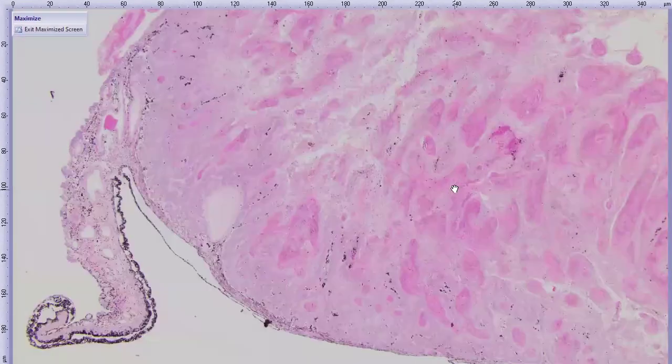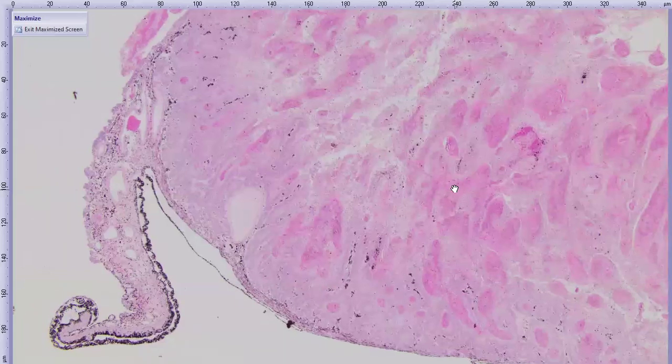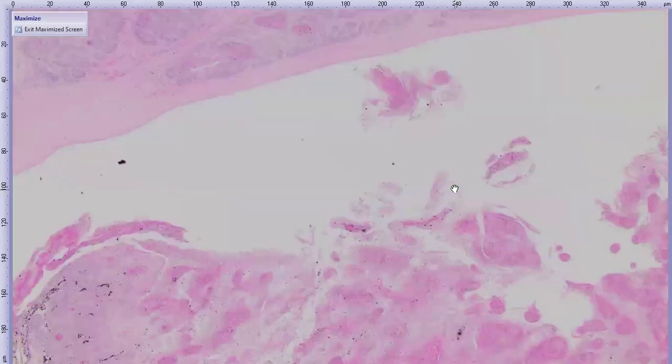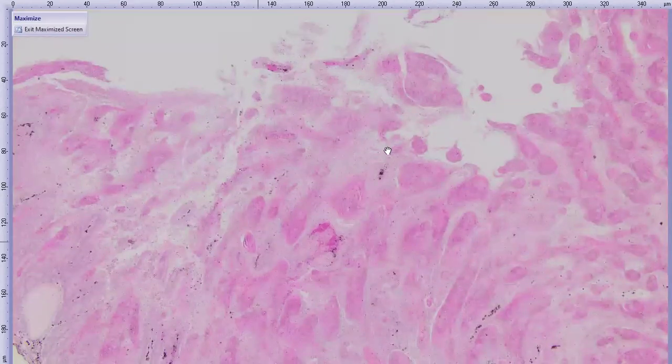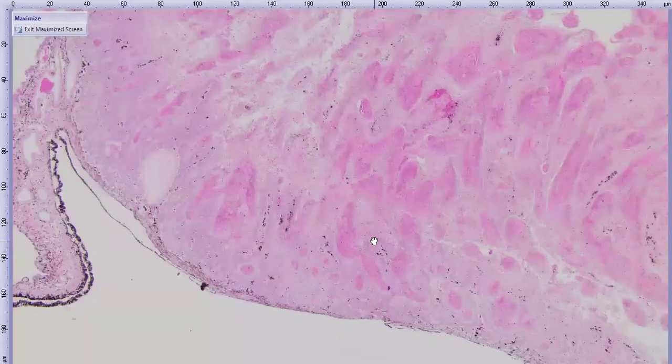And this pink in this tumor is keratin. So it's making a lot of keratin, and you can see it floating around everywhere. There's even a piece of keratin just out here. And some of these areas are basically just necrotic tissue with seeds of keratin multifocally. So a really keratin happy tumor.